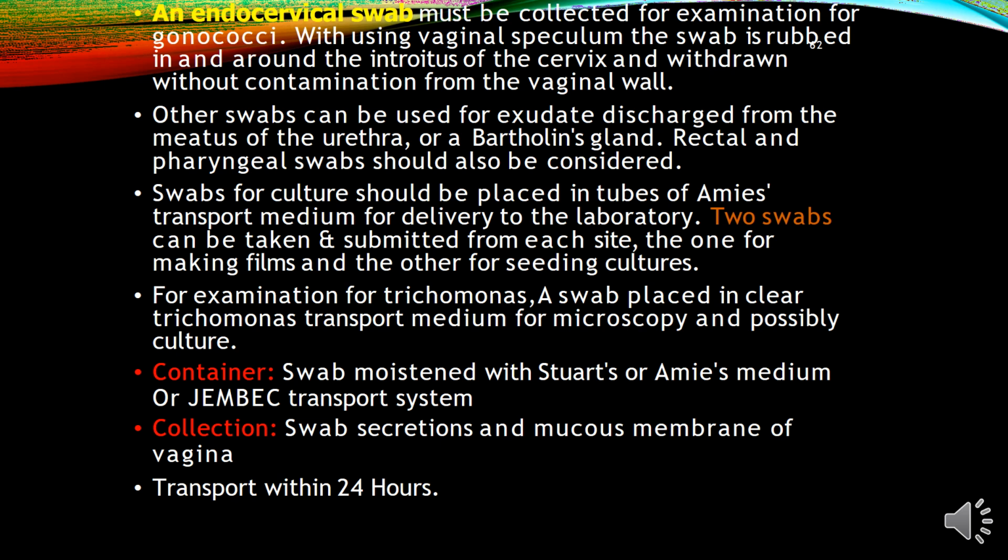For examination of trichomonas, a swab placed in the trichomonas transport medium for microscopy, and possibly a culture, should be done. The container should have moistened swabs with Stuart's and Amies media or Jembec medium for gonococci. Collection of swabs and secretions from the mucous membrane of the vagina should be done. Transport within 24 hours.